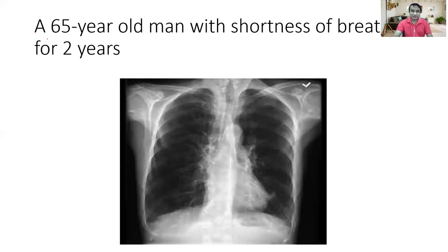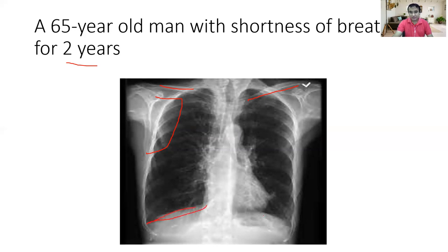Similarly, there is a 65-year-old gentleman with shortness of breath for two years. The clavicle appears horizontal and the scapula lies within the lung field — so this is probably the AP view. There is increasing radiolucency in both lung fields, and notably the diaphragm is flat rather than domed. This is the chest X-ray of a hyperinflated lung field — features include flattening of the diaphragm and hyperlucent lung fields, which are common features of emphysematous lung, consistent with COPD.